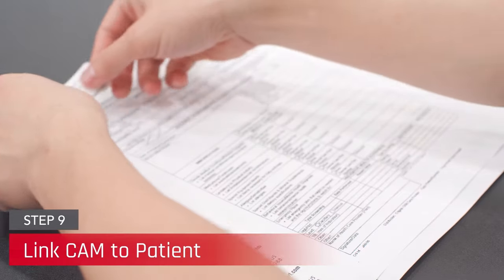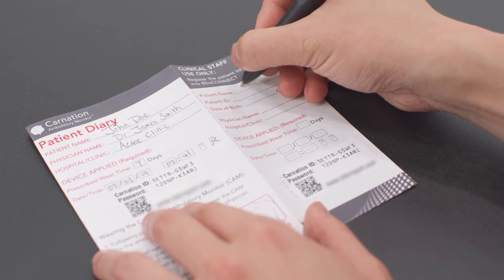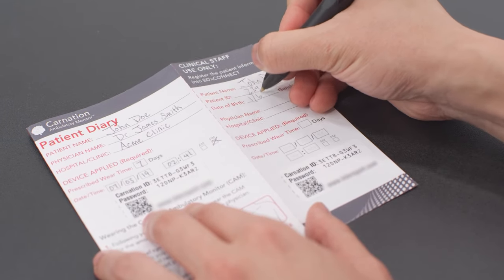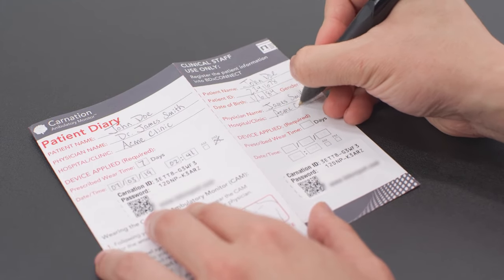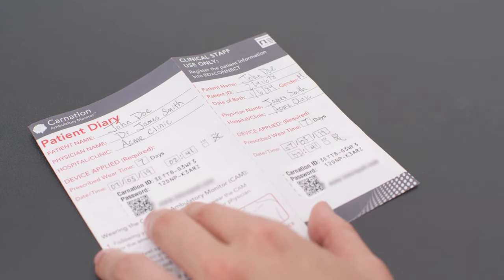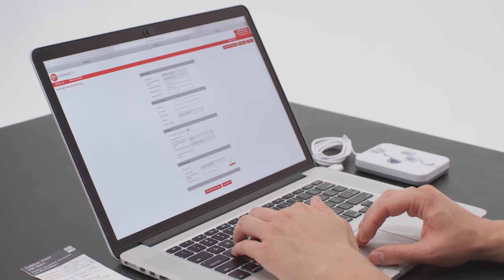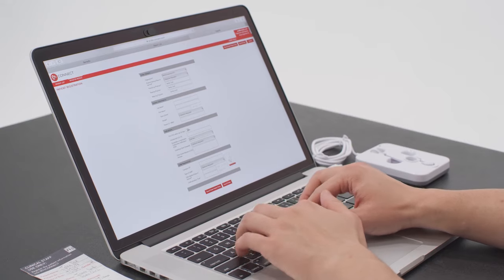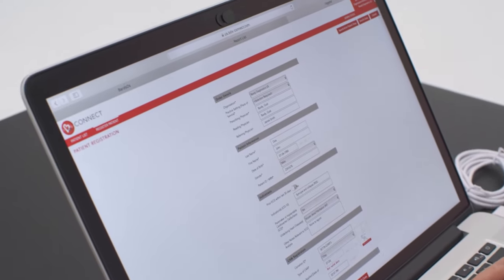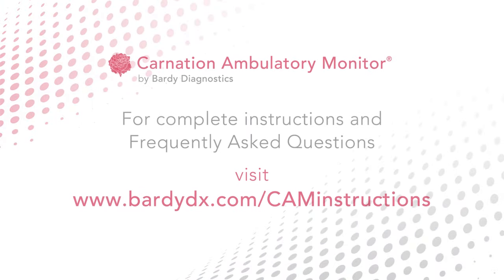Now that the CAM patch is successfully applied to the patient, it is vital that the CAM is correctly linked to the patient's medical records. Place the CAM ID barcode stickers found inside the CAM box onto any pertinent paper records. Complete the tear-off portion of the patient diary, which will be utilized when registering the CAM on the BDX Connect patient management web portal. This is especially important if your workflow does not allow you to immediately register the CAM following the patient visit. Finally, register the patient as early as possible on BDX Connect. It is imperative that the patient is registered on the same day of their visit to avoid issues resulting from returned CAMs that are not linked to a patient.